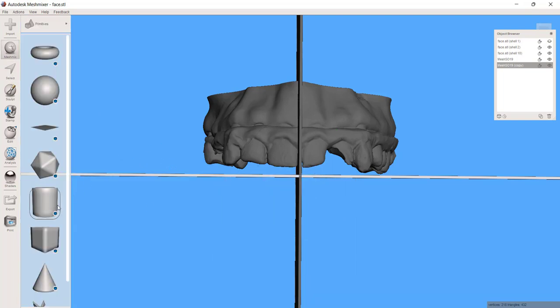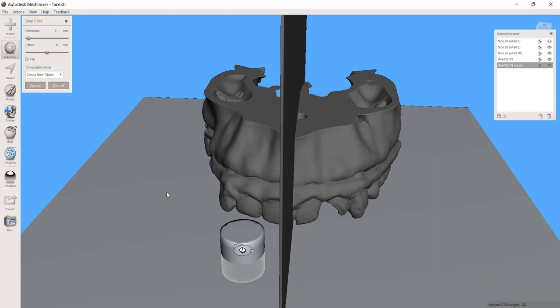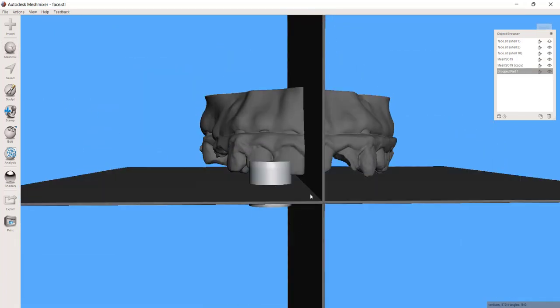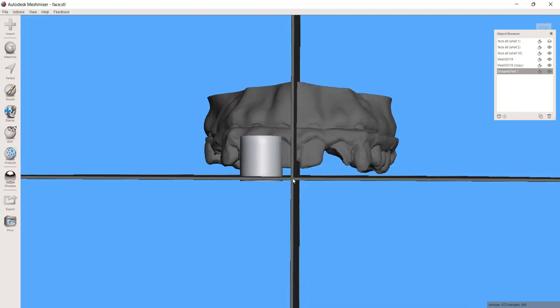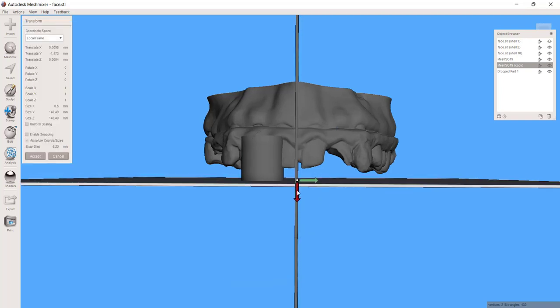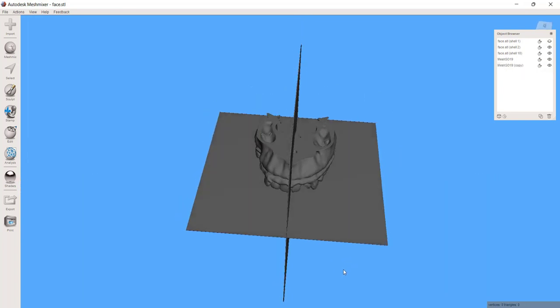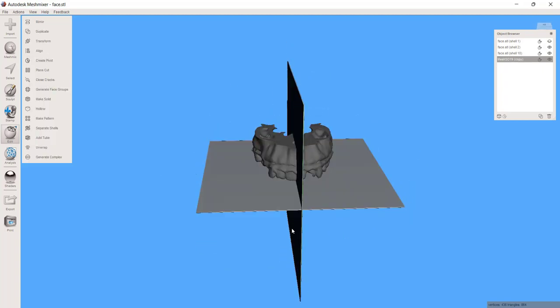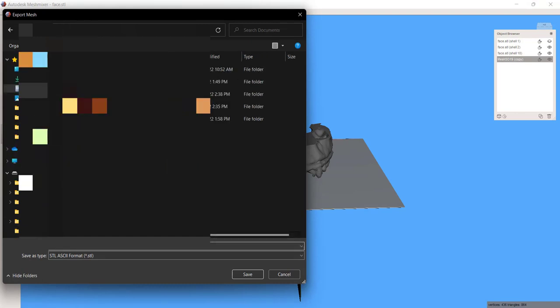I also know that the average central incisor is 10 millimeters in length. So I could pull in some kind of object — actually, for a guy with a longer face like this, I'm going to say an 11 millimeter tall central incisor. And I could just simply pull this over and look at how we compare lengthwise. Pull that up to the gingival margin. And if we wanted to give him an 11 millimeter central incisor, we can just pull this down until we correspond to that. So what I've generated here now becomes a facial plane that I can use during my setup.